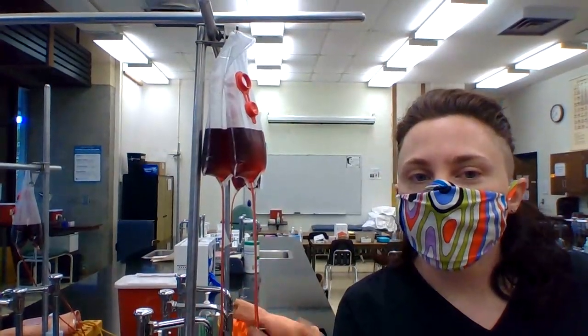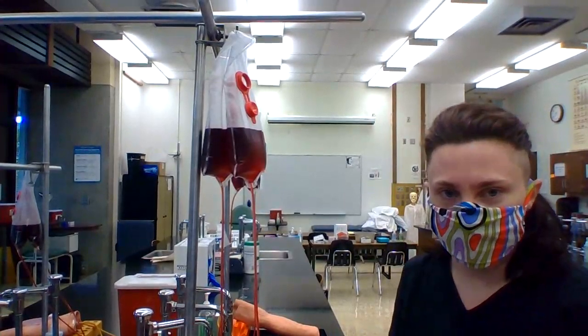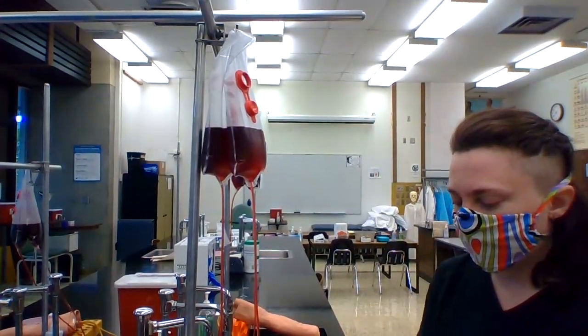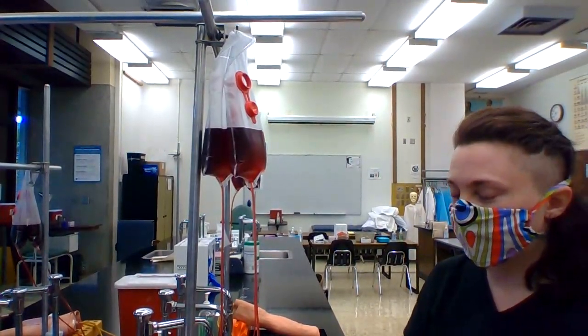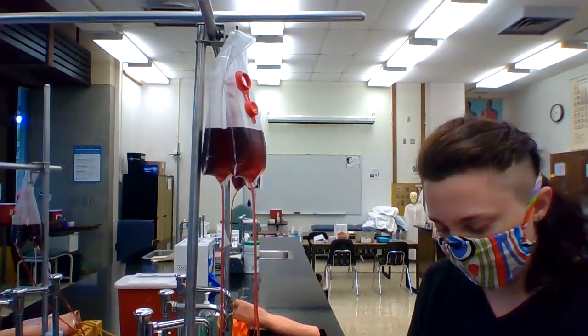Alright, so this is going to be a faster video. I'm going to actually do this at the pace that I would do if I were working with the actual patient. If you want more instructions or more detailed steps, you can go check out that other video that I just made.